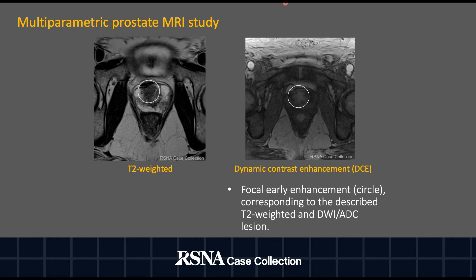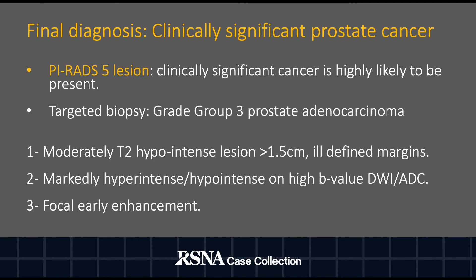Here I'm showing you the same T2 weighted image, but now alongside a corresponding image from the dynamic contrast enhancement series. Within the circle, you see focal early enhancement corresponding with the T2 weighted abnormality. These MRI features are consistent with a PIRADS 5 lesion, meaning that clinically significant cancer is highly likely. To recall: this lesion was moderately hypo-intense on T2 weighted imaging with ill-defined margins, showed restricted diffusion as evidenced by marked hyper-intensity on high B value DWI and hypo-intensity on ADC, and showed focal early enhancement.